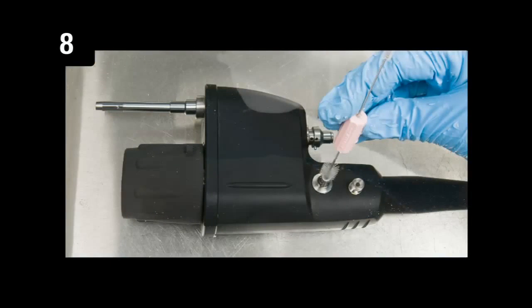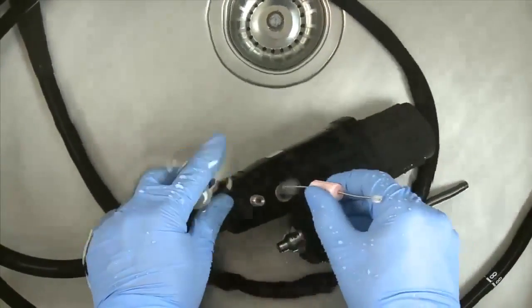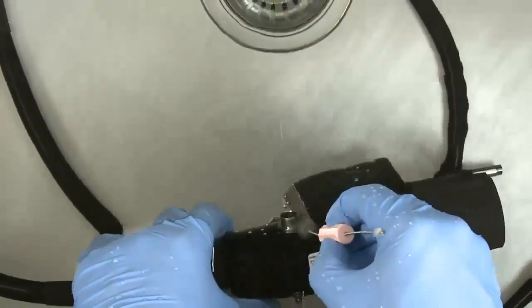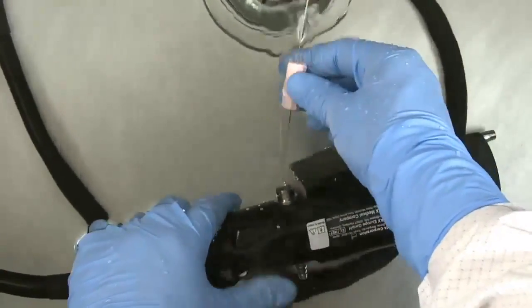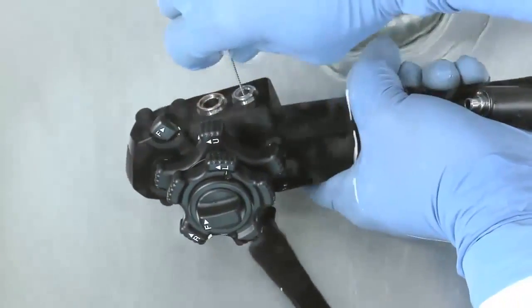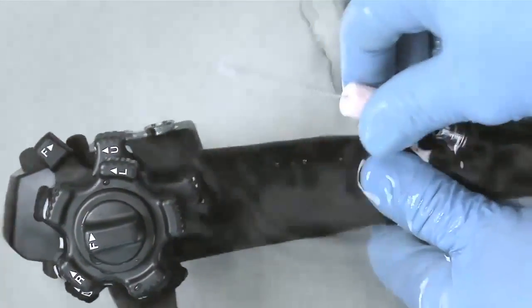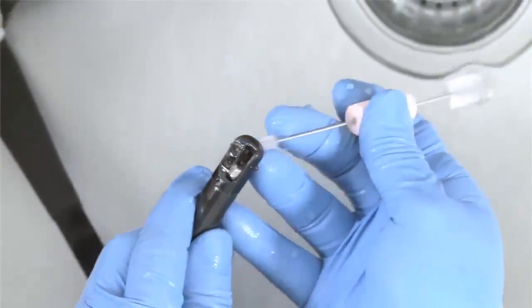Step 8. Brush the endoscope's ports. Starting from the suction nipple at the PVE connector, begin brushing all ports by inserting the small reusable PENTAX brush. Be sure to follow the PENTAX Reprocessing Manual instructions. Continue the brushing process on the air, water, and suction valve cylinders at the control body, including the biopsy inlet channel. Remember to brush behind and around the elevator lift mechanism.